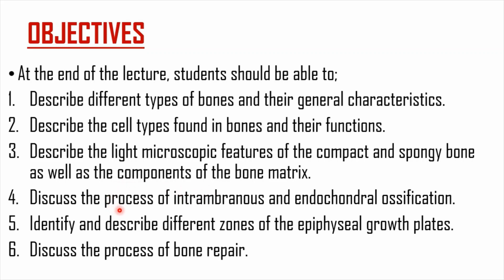You discuss the process of intramembranous and endochondral ossification, identify and describe different zones of epiphyseal growth plates, and lastly, you discuss the process of bone repair.